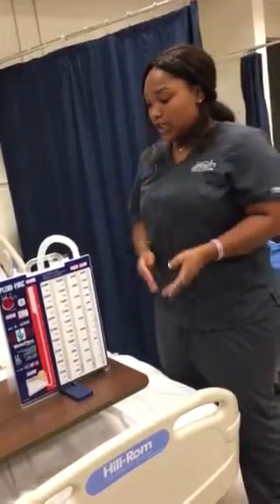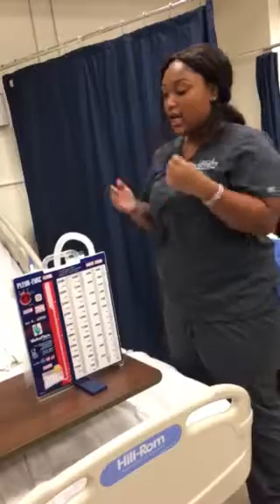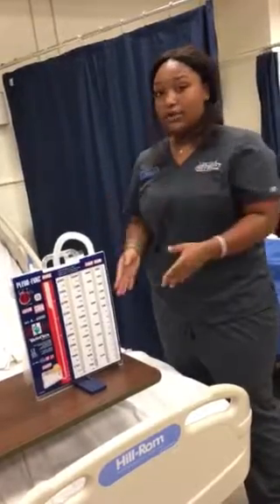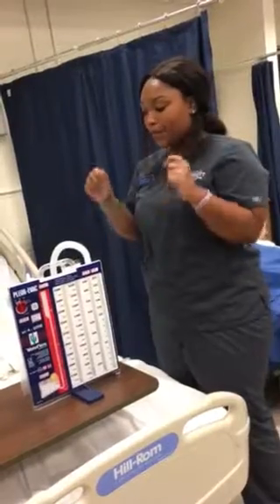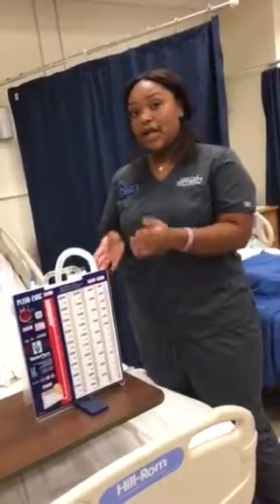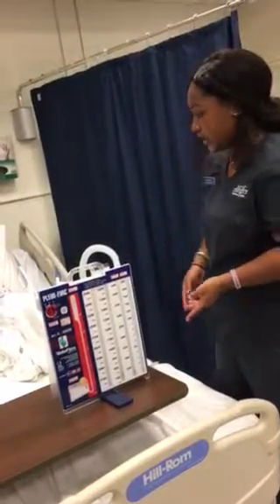And when you have to change these, it's typically a two-person job, because you don't ever throw these away. You just put them in the biohazard container. So one person will be holding the tubing and making sure the patient is okay, while the other is trying to attach the new PLEUR-EVAC to it. So that is how that works.